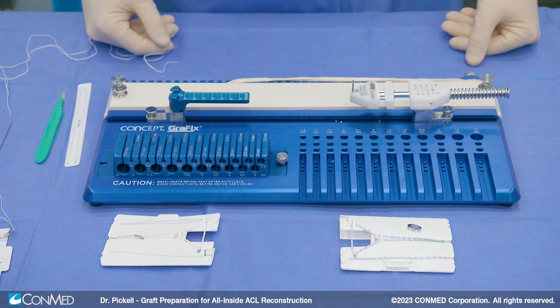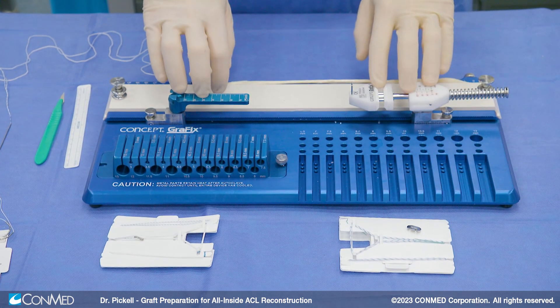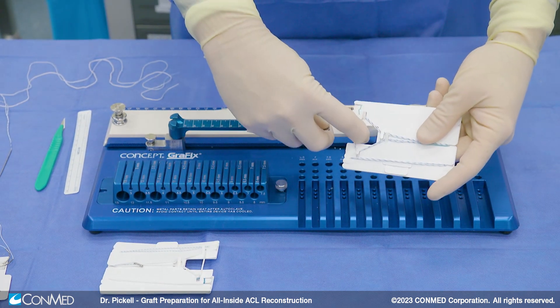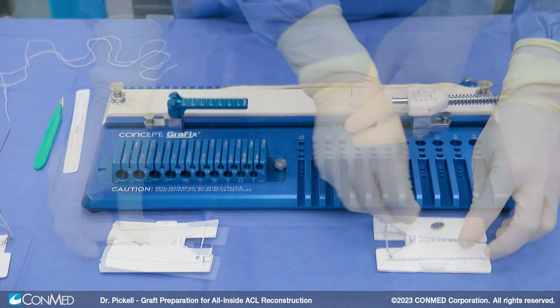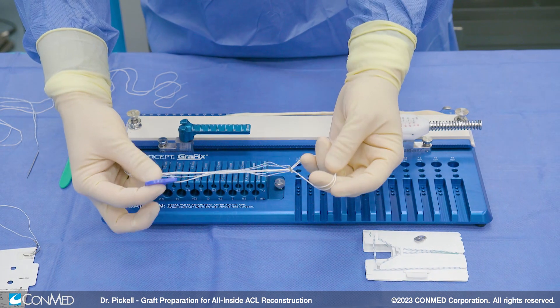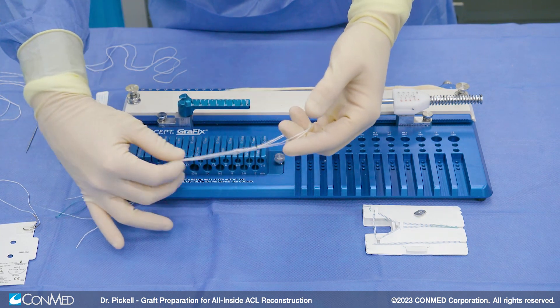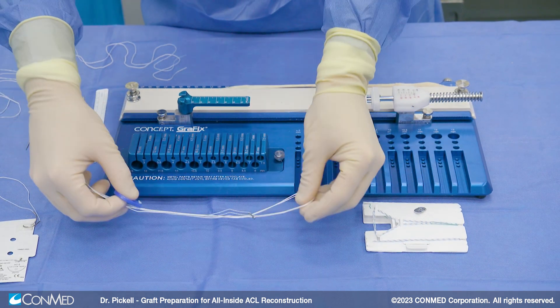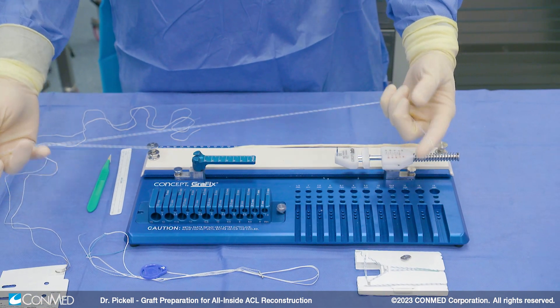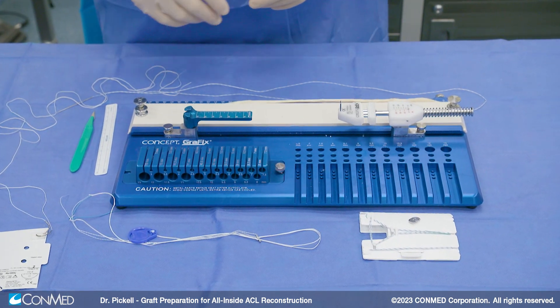This is the typical graft prep that you would see for an all-inside ACL. We've got our semitendinosus tendon here that we've harvested and ready to go. We've got our tensioning device — we're going to secure our buttons on. We've got our tibial-sided button, which is an adjustable loop tibial button that comes without a button; we'll attach our button at a later date. We've got our femoral-sided button that has the button already secured to it. This is an adjustable loop as well, and here we've got one that's been detached. You can see one of the nice features in this system is it's got this blue tab, which allows us to decrease or pull the button back if we've over-tensioned our graft, so we can loosen it — and that's new to this system. We have our looped stitch, which is going to be used to secure our graft, and then we've got just a standard Hi-Fi number two stitch. This is going to be our bailing stitch, so it'll make more sense in a second here.